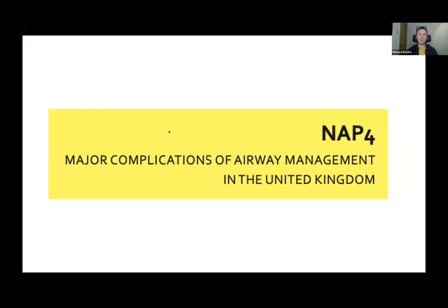But there are lots of system factors that were highlighted as well. So thinking about less experienced personnel, reduced availability of advanced airway equipment, and a failure to use those safety-enhancing processes that we've been keen to build into pre-hospital care in the time since, things like pre-intubation checklists. Now, this is obviously an observational study of in-hospital practice, but you can see how those system factors translate into our work beyond the hospital doors.